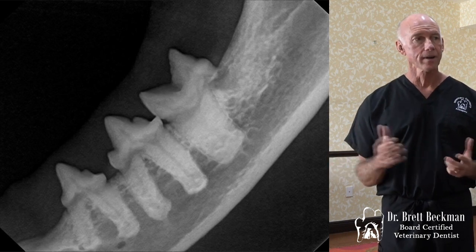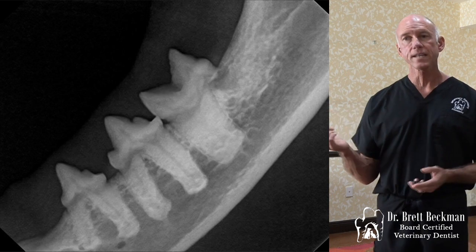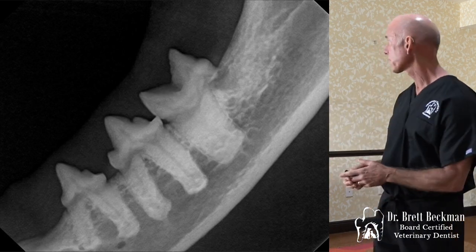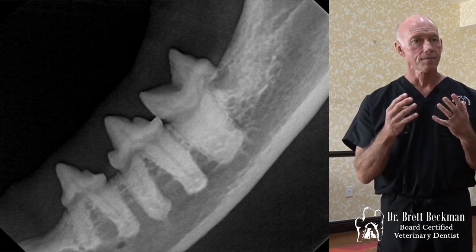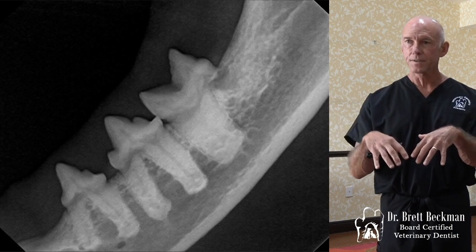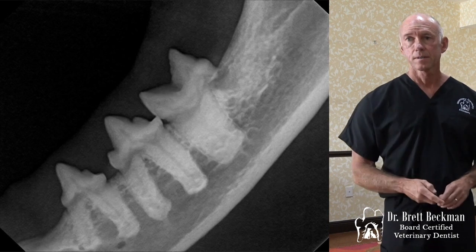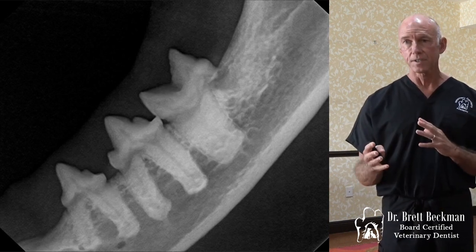The mesial root has a periodontal ligament space all the way around it. What you're seeing is tooth resorption, likely the original insult, and then because of the breakdown of the root, you get the bacterial ingress and the inflammation that produced this lesion as that tooth was resorbing. So kind of a perio lesion.